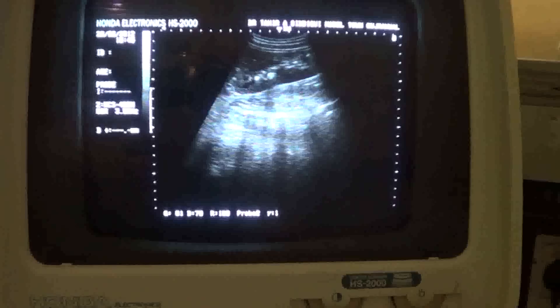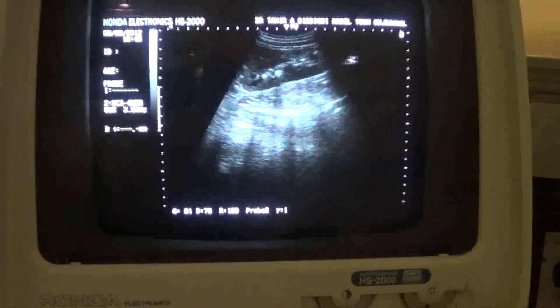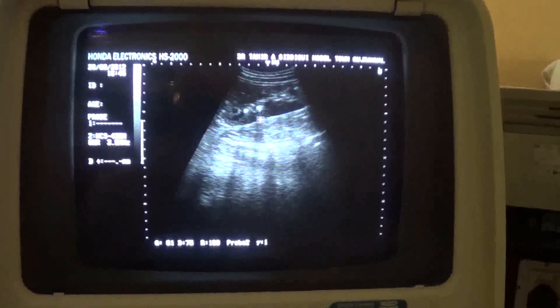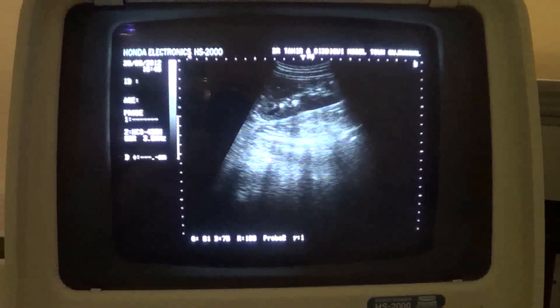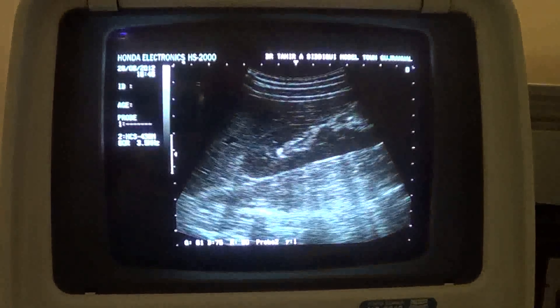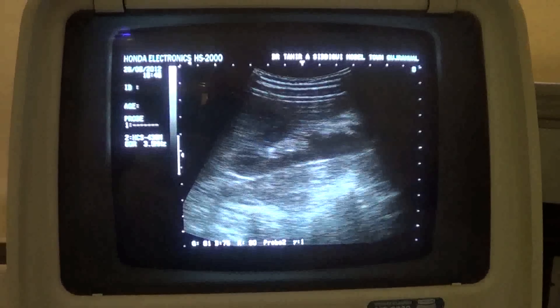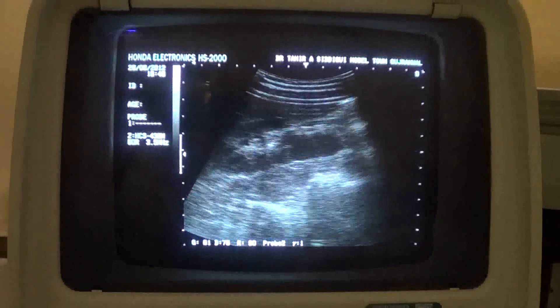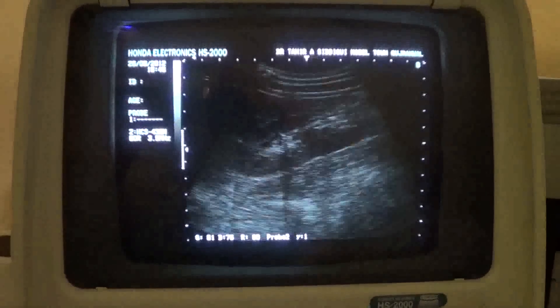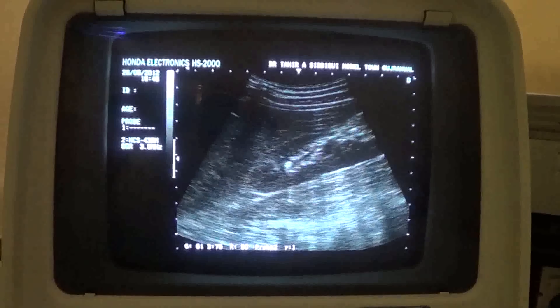As you can see, this is the right kidney and these are two echogenic areas — both are giving posterior shadows. It's better to magnify and now see these echogenic areas giving posterior shadows. There are two in this region.